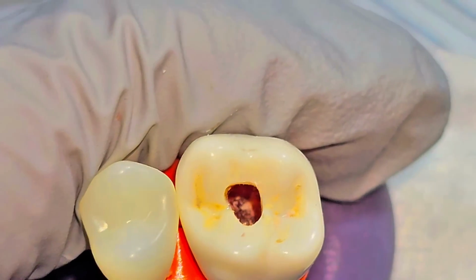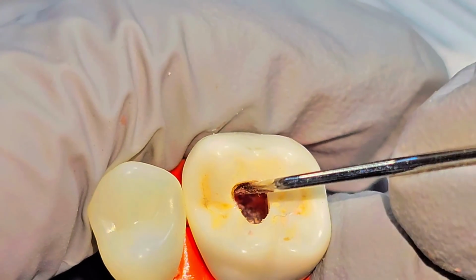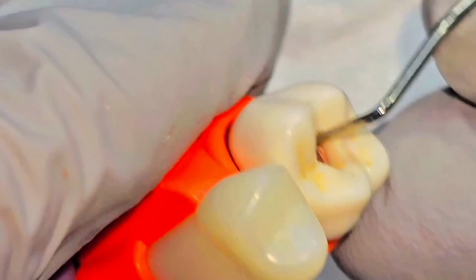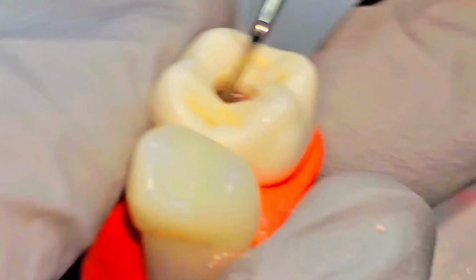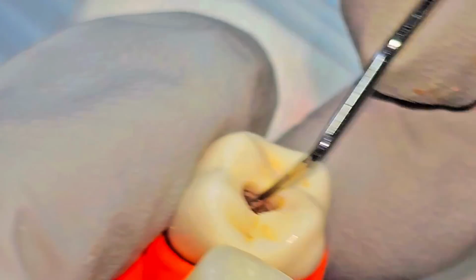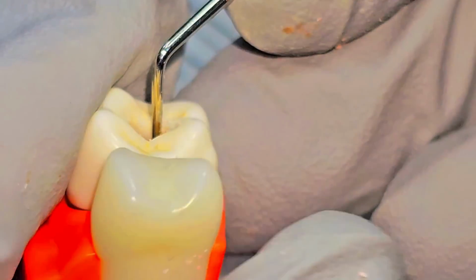And for now there are no pulp horns present. Now we have the straight access, and also here straight access, and we have a straight access on the palatal as well.